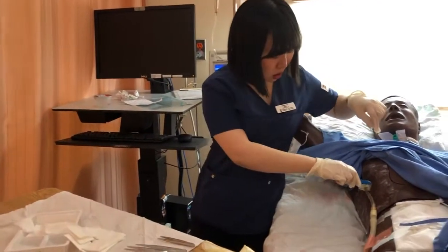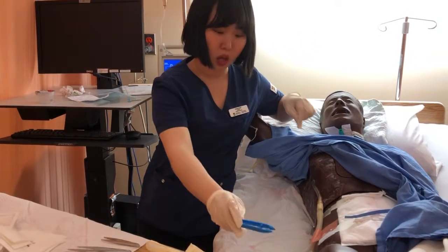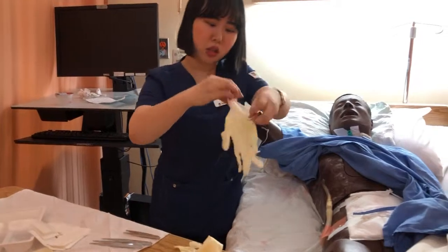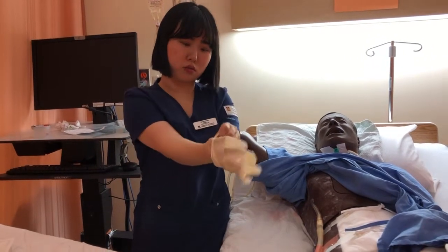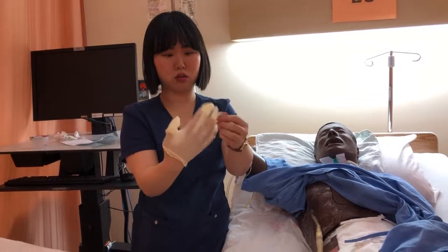Out the diluent here. New pair. And this goes to the garbage. I'm a little bit short on gloves, so I'm gonna go out and get it. How many minutes? 12. 12 minutes. You're at 12, I mean. Yep. I'm at 12. Okay. You're doing good.